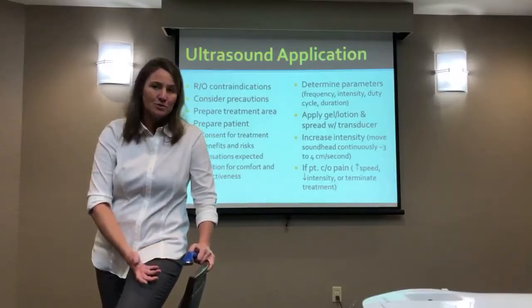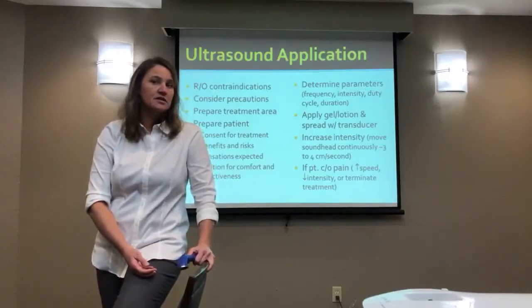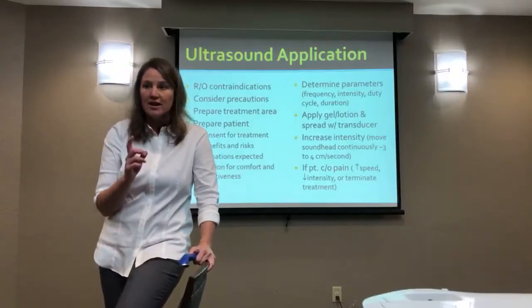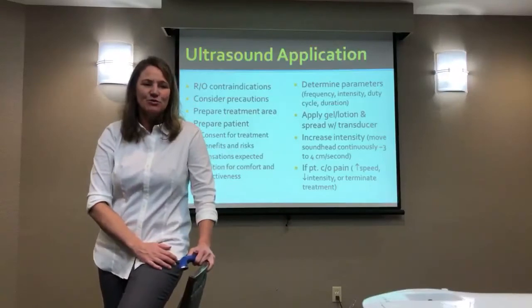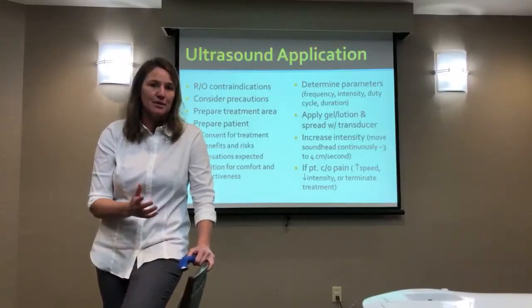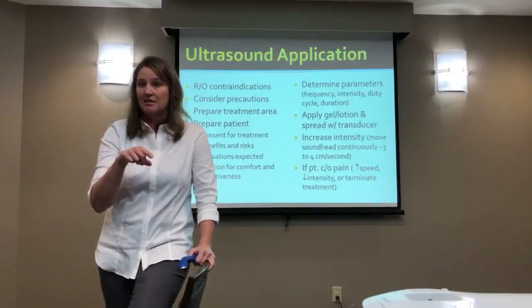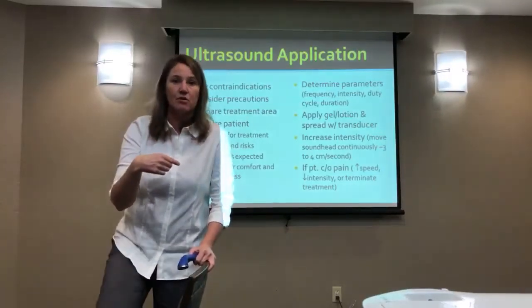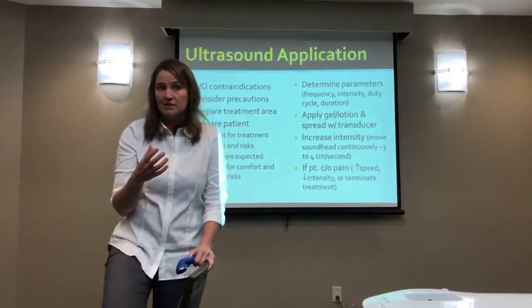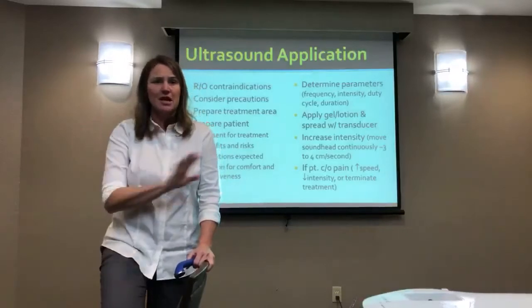You don't feel much with ultrasound, so if you have that skeptical person who is on the lookout for fraud, for Medicare purposes or something like that, you do really have to communicate with the person, because they may not tell you to your face that they think you didn't know what you're doing, or that you are doing something unethical. They may or may not say it to your face. They may be thinking it as they go out the door. And that could be any treatment, anything you're doing.